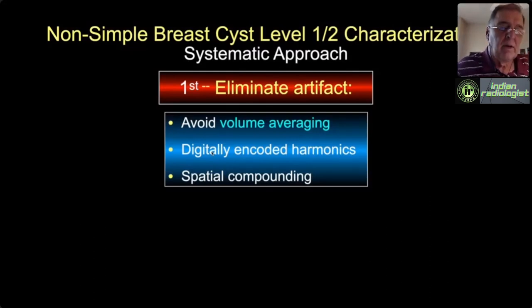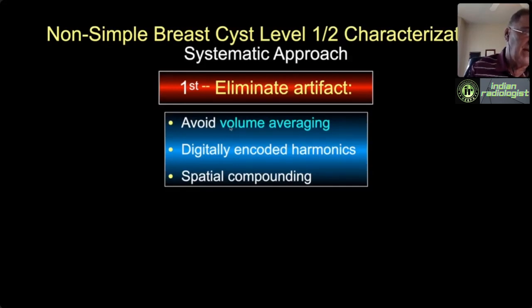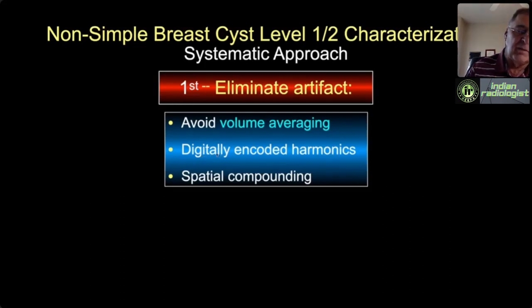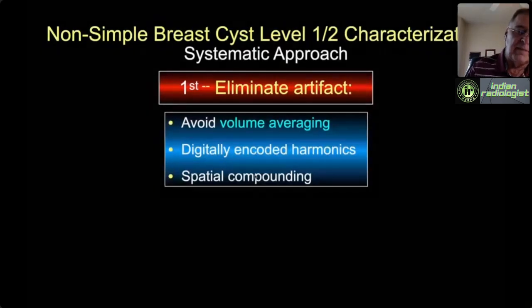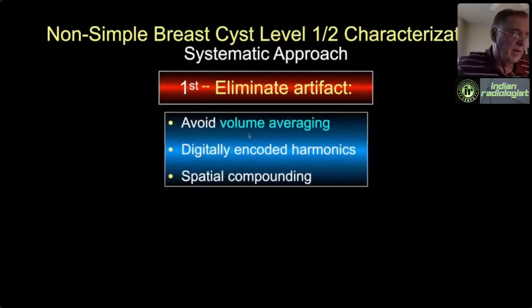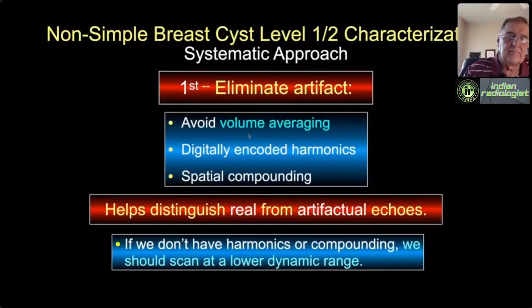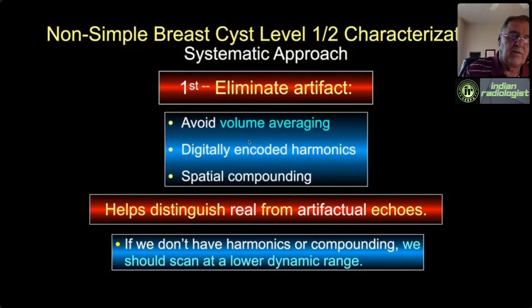We can make sure we're focusing correctly, because without focal zones at the right spot even a high-quality machine will volume-average black microcysts with white fibrous tissue and create solid-gray-appearing centers. One way to avoid creating artificial non-simple cysts is by using harmonics and spatial compounding, and carefully moving focal zones. Without harmonics or compounding, you probably need to scan at lower dynamic range—around 50 dB instead of the 70–105 dB range of top-of-the-line machines.